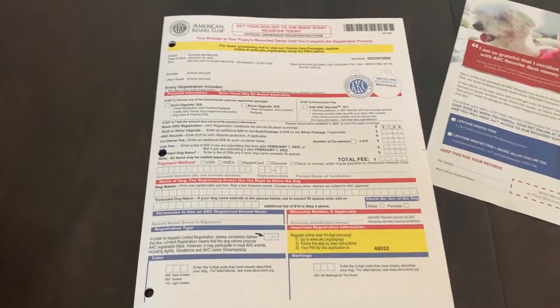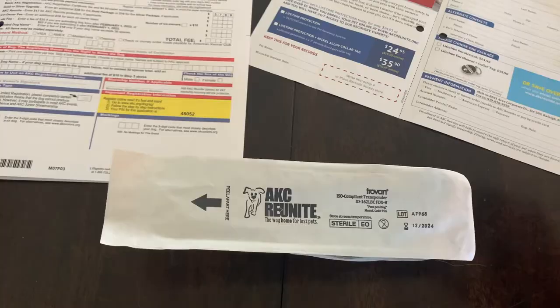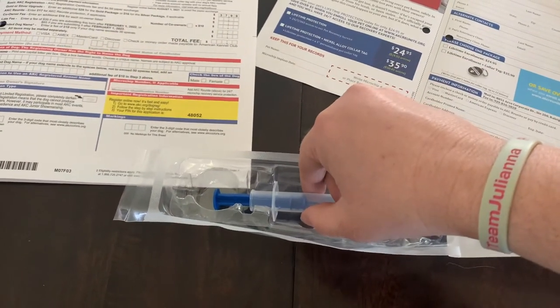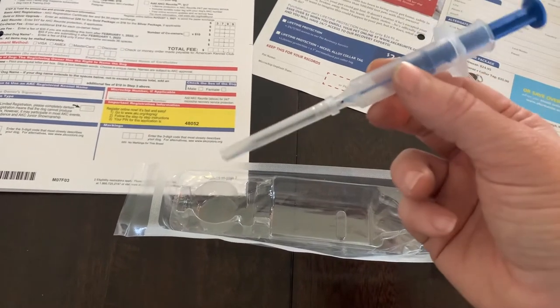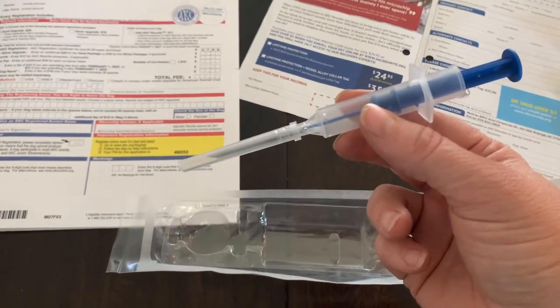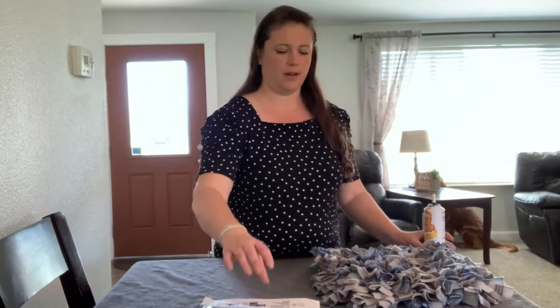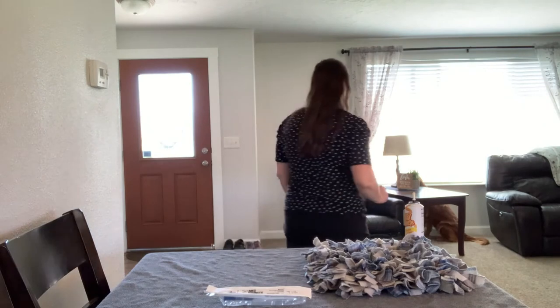If you do the registration for the microchip at the same time you register your dog, it's only $17 for a lifetime — so that's usually what we do with our dogs. It comes in a sterile package with a needle, and inside the needle there's a microchip. Before we get started, I like to get everything set up. We have a snuffle mat with some of the puppy's dog coat in it to keep them distracted, and some of their favorite treats. Now I'm ready to grab the puppy.